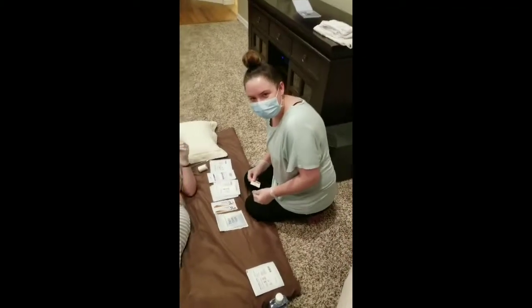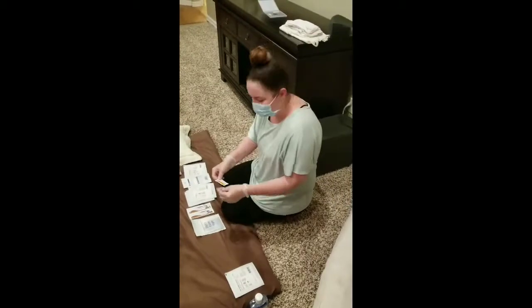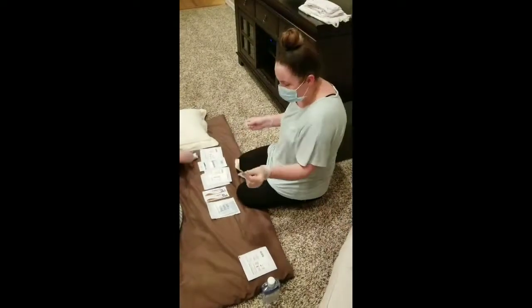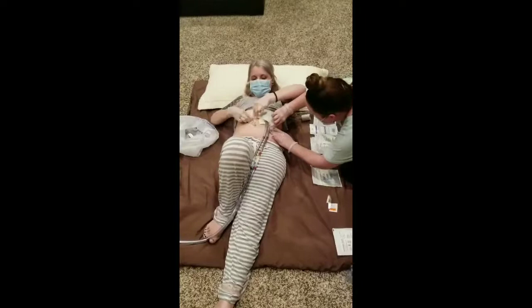Hi! Sonny and Angel here. We thought it'd be fun to walk you through a dressing change. So as you can see, we both have gloves on. The first thing we're going to do is take our alcohol pad and we're going to remove the dressing that's already on there.